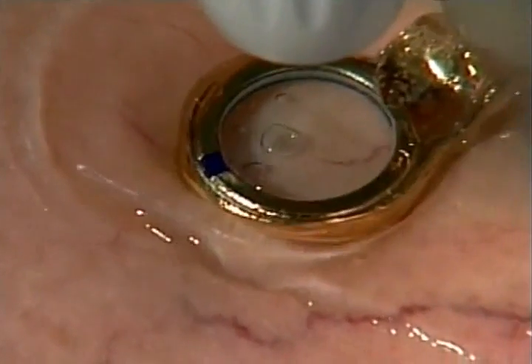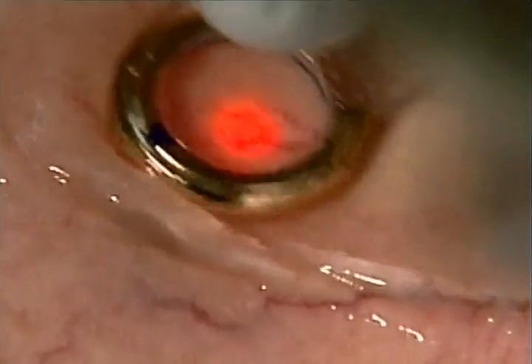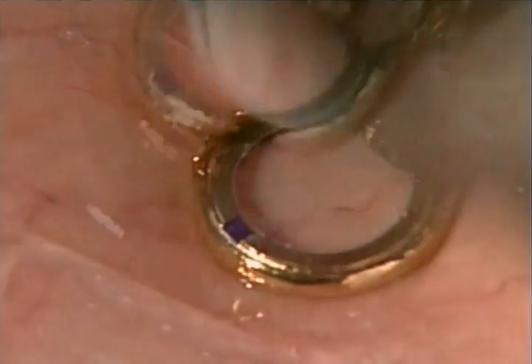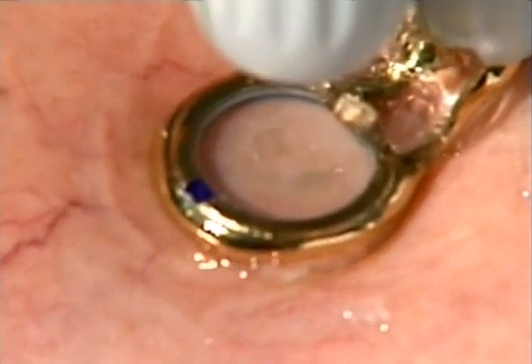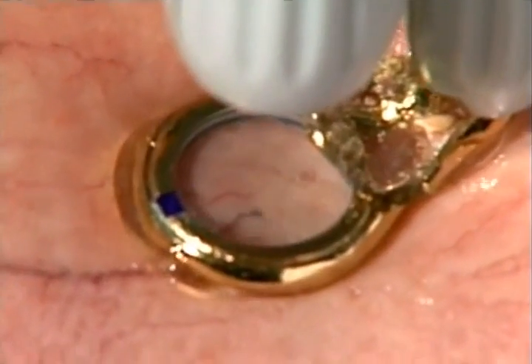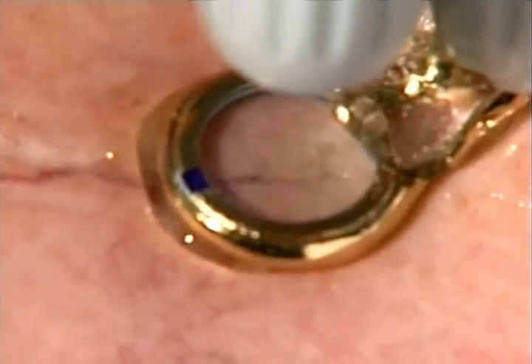All right, so we got about a 2.6, and the vessel, I'm going to actually increase the fluence just a little bit. But we did a comparative study with that, using the Lyra versus the sotradecol sclerotherapy, and the results are very comparable. We got less post-operative problems with post-inflammatory hyperpigmentation with the Lyra, and the results were very good.